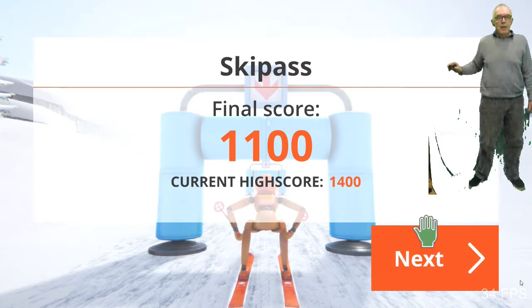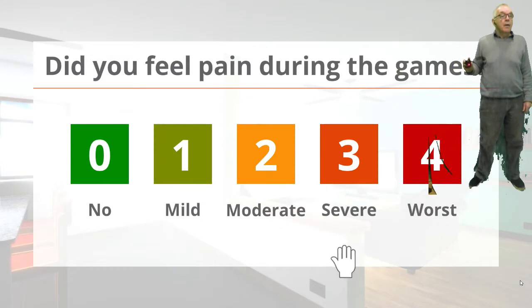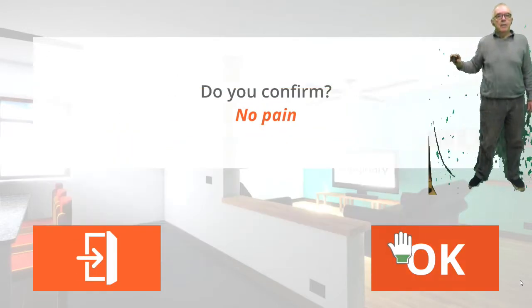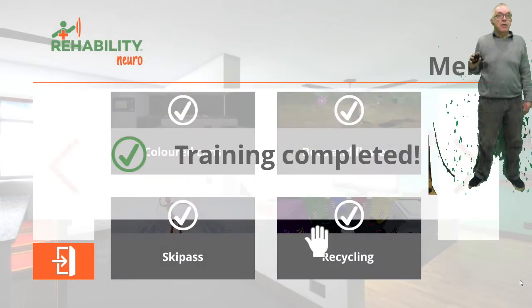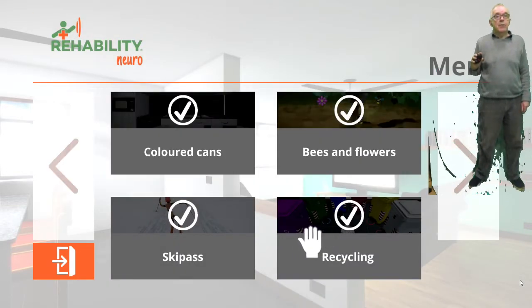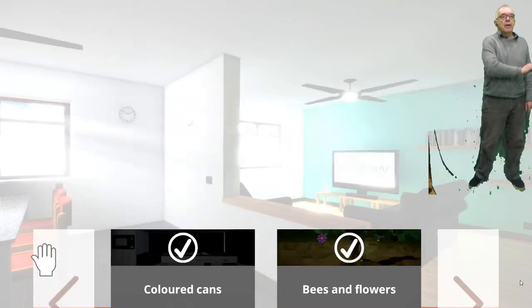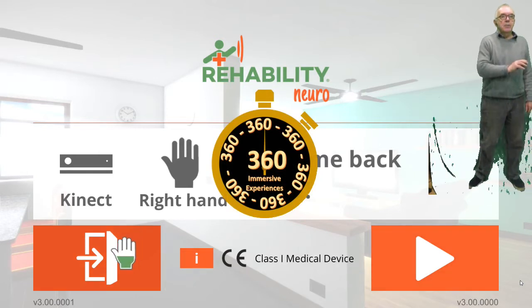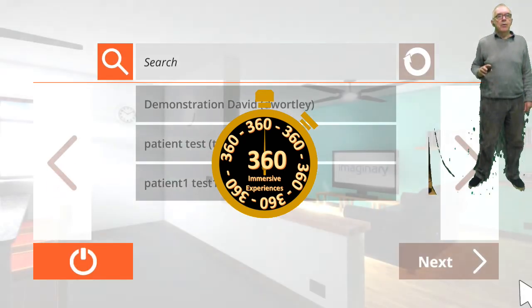Never mind. So I played the 4 games and I can track my progress. Did I feel any pain during the games? No, I didn't. I can say okay. And this provides very useful feedback to the physiotherapist. So that's just a quick run through, an example of some of the rehability games. So I'm going to exit from it now and go and close the program down.